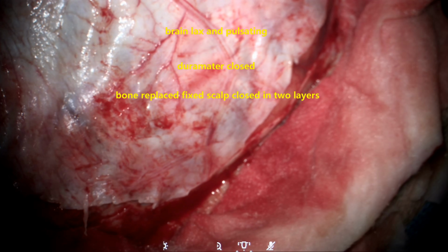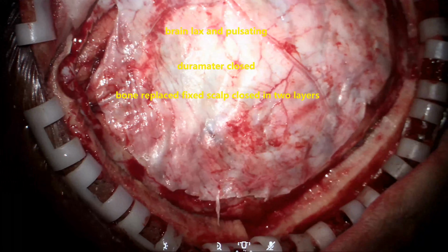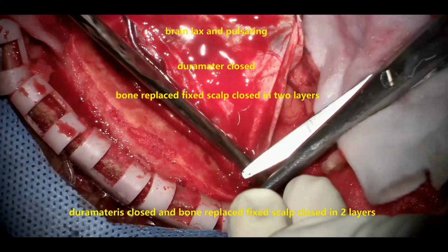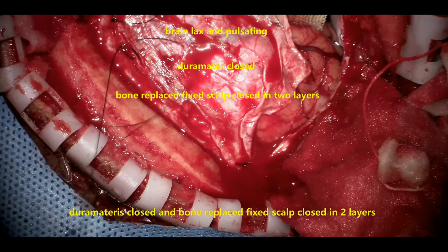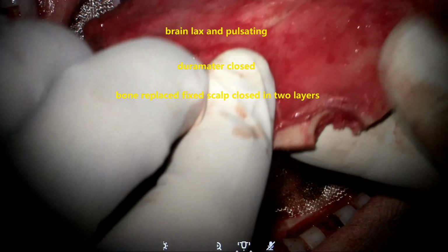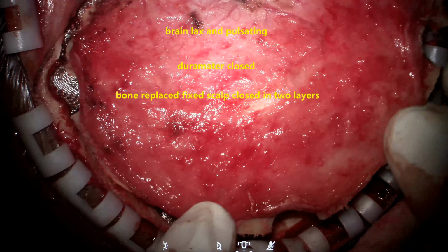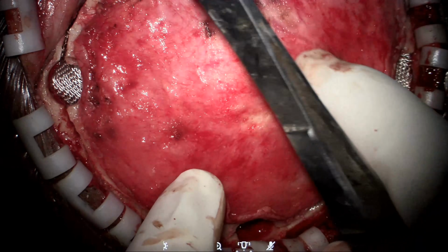This is the dural closure, as watertight as possible, and 5-0 or 6-0 Ethilon is good enough with continuous suturing of the dura mater. Sometimes if there is dural loss or shrinkage, we use the pericranium as a graft. This is the bone replaced and fixed. Scalp is closed in 2 layers.